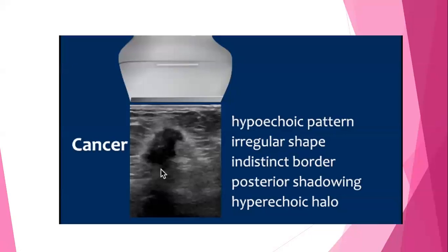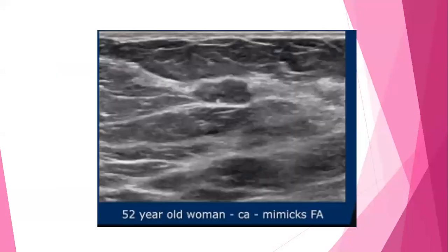And when you're looking at the mass, we're looking at the surrounding parenchyma. It has an echogenic or hyperechoic halo. This is a feature usually that would indicate that this mass is likely to be malignant. And whatever we are seeing appearing as the echogenic halo around it is all part of the abnormal mass. So there may be some areas of infiltration within that echogenic halo. So as much as we see the mass looks hypoechoic, the surrounding parenchyma there has some distortion and parenchymal changes, so likely also infiltrated by the mass.